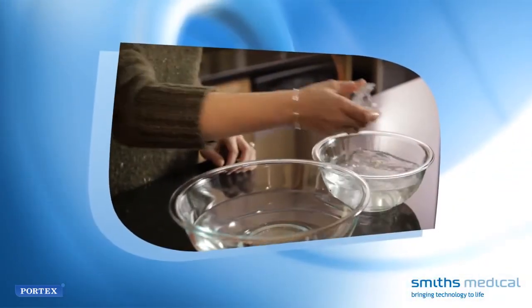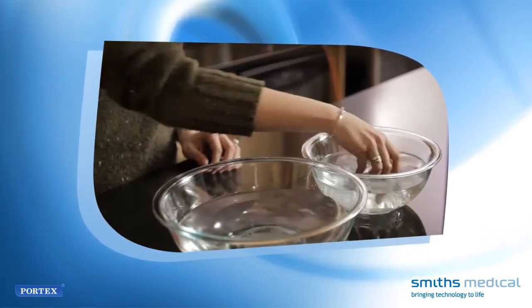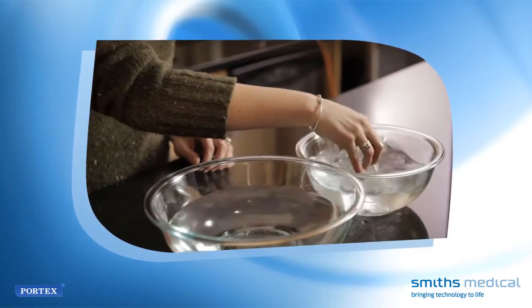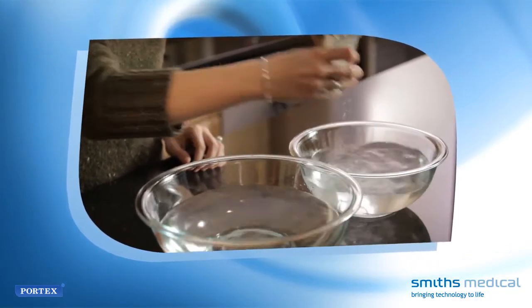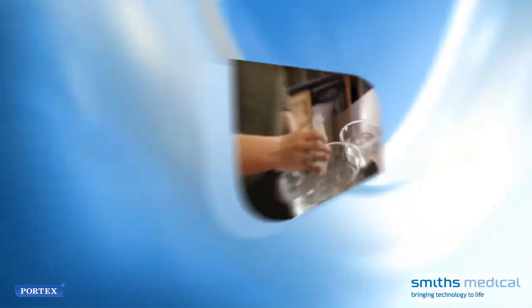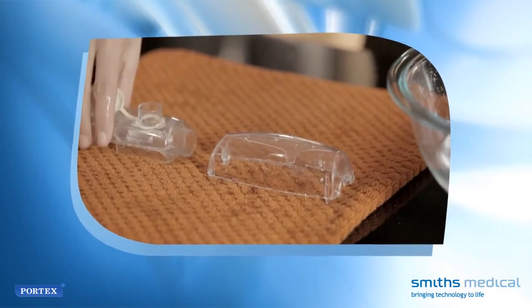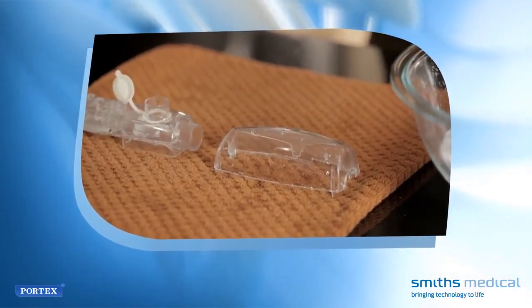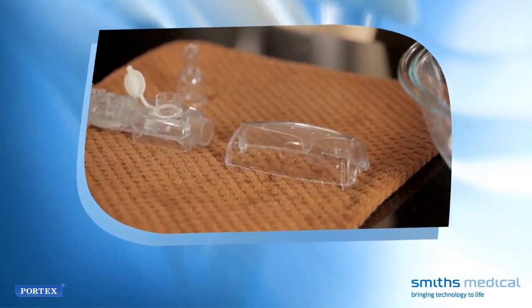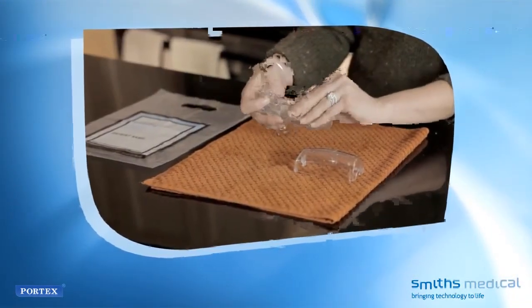When you have disinfected using isopropyl alcohol or hydrogen peroxide, rinse the device with sterile water or water that has been boiled for at least 5 minutes, then allow the Acapella to cool to room temperature and dry. Drain the device by placing it with the mouthpiece end downward in a resting position on a clean towel and allow the device and mouthpiece to air dry. Lastly, reassemble the Acapella for your next therapy session.